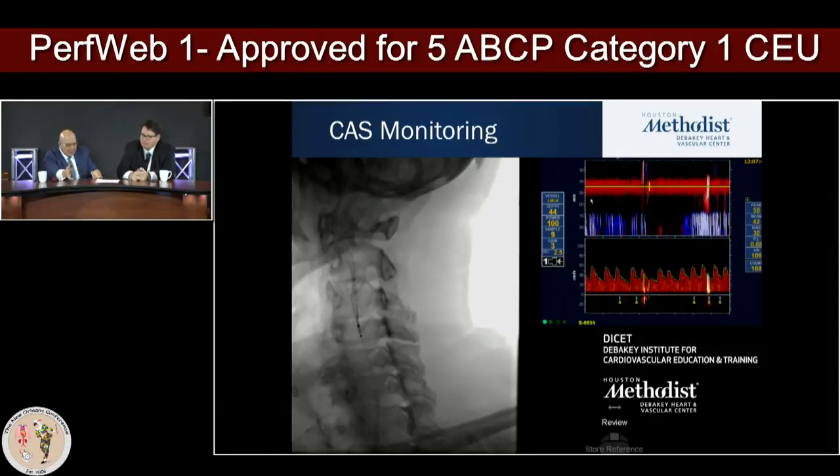In that particular procedure, and many other procedures, we know, even when we open valves, the mitral valve and the left atrium, you see it on the TEE, you see the starburst floating around. That is air. And that air is going to eventually make its way through the system. And we just accept it. But I think we can learn something about how to get rid of that air.